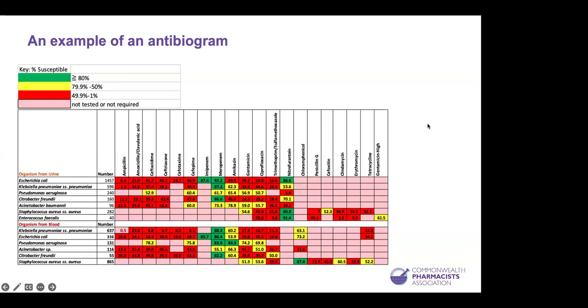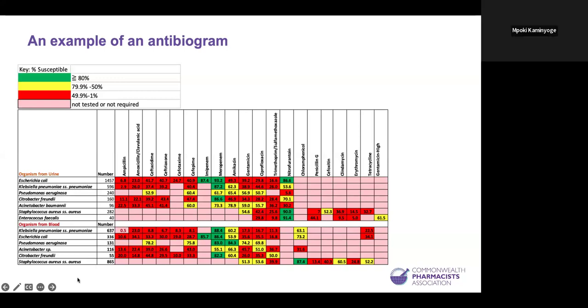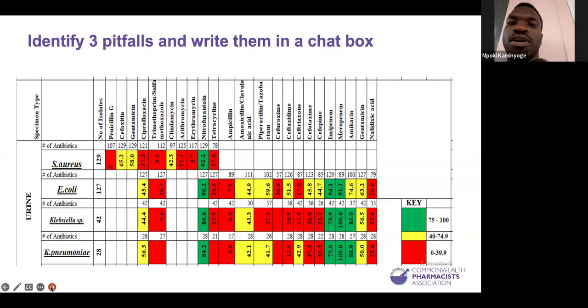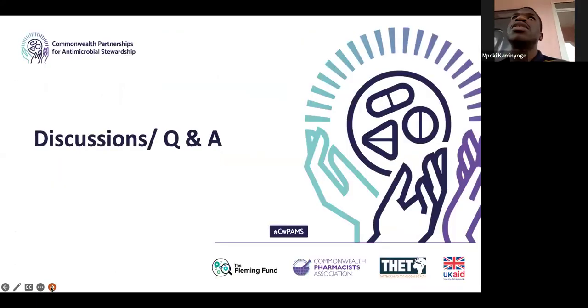Okay. Thank you. As a facilitator at a certain site, the challenge is that in most cases some doctors may order culture and sensitivity, but according to the levels of facilities, maybe in Tanzania, there are some facilities where they don't have the culture and sensitivity materials.